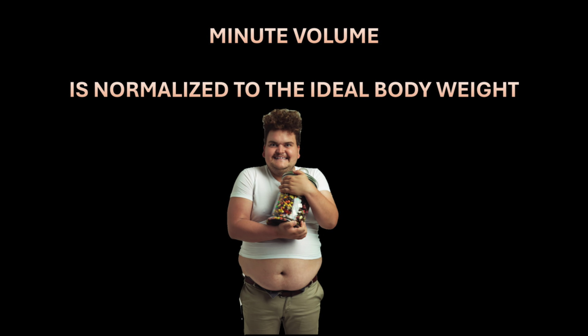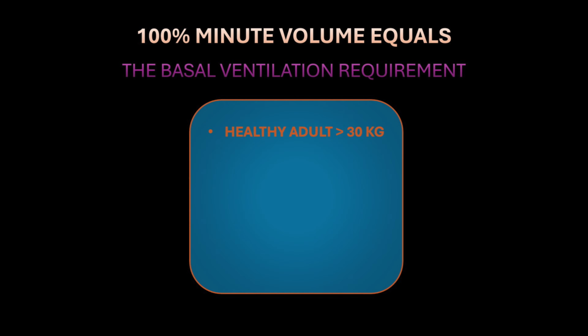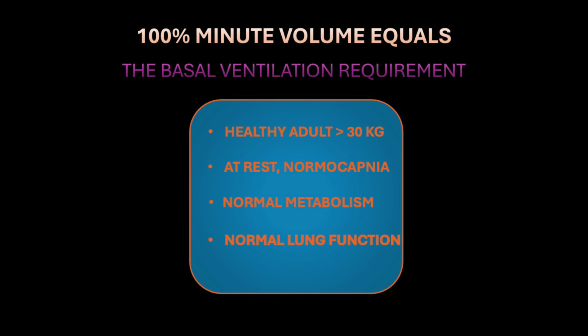Minute volume is normalized to the ideal body weight. 100% minute volume equals the basal ventilation requirements for a healthy patient at rest, with normocapnia, with normal metabolism, and normal lung function.